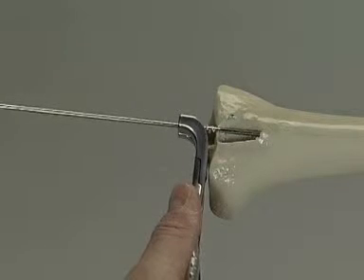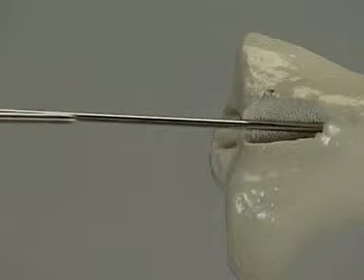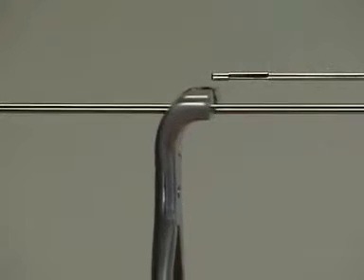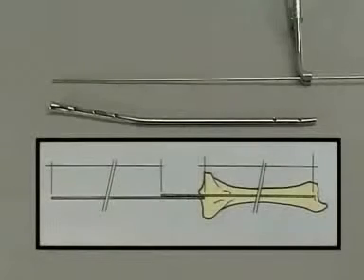The required length of the nail is now determined. A second reaming rod is placed parallel to the inserted rod and the exposed end marked on the second reaming rod with the holding forceps. As both rods are the same length, the protruding part of the second rod corresponds to the length of the rod lying in the medullary canal, thereby showing the length of the nail.